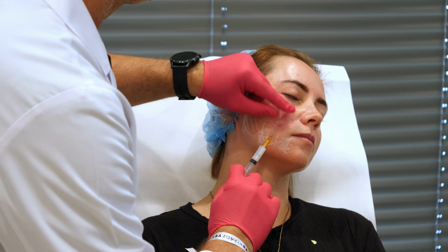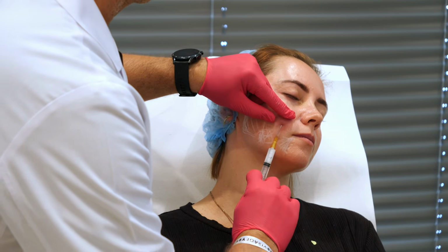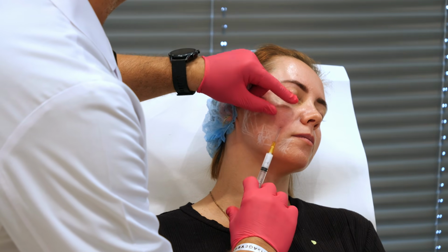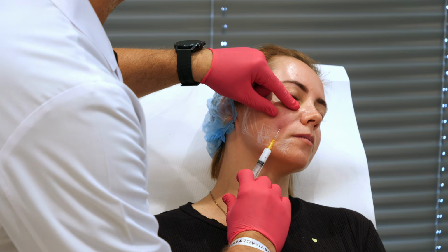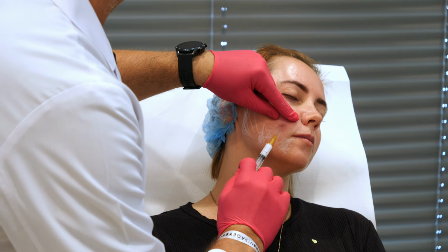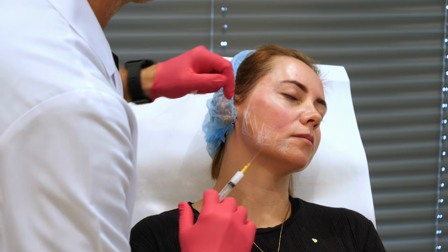A little bit more, because we obtain a better skin quality, but with this product we can obtain a variable amount of collagen in this area and produce a little volume here with a natural result.